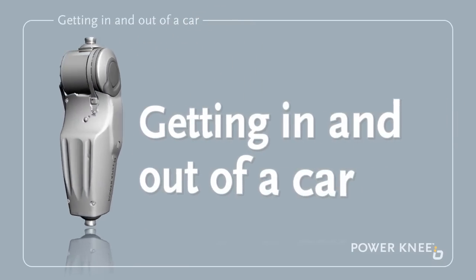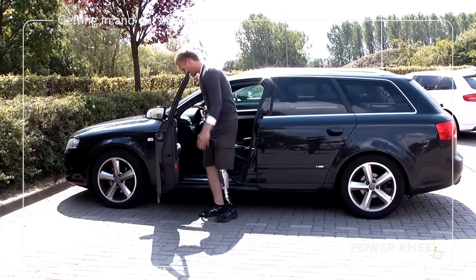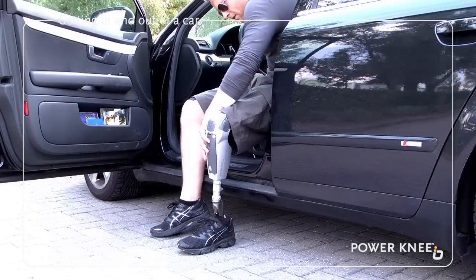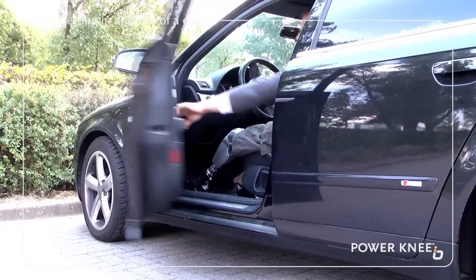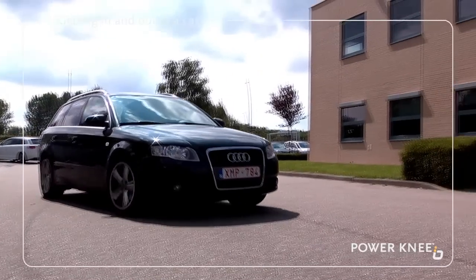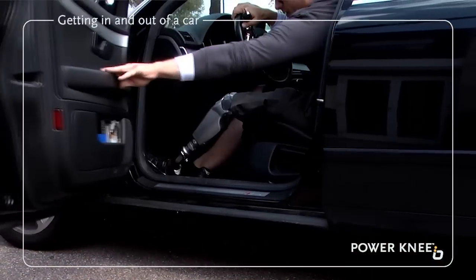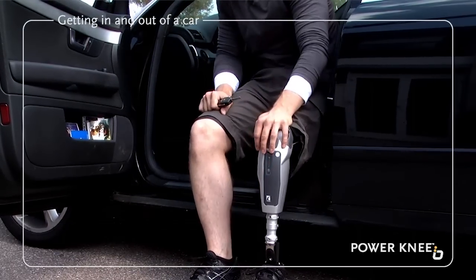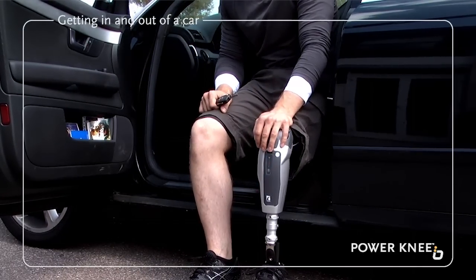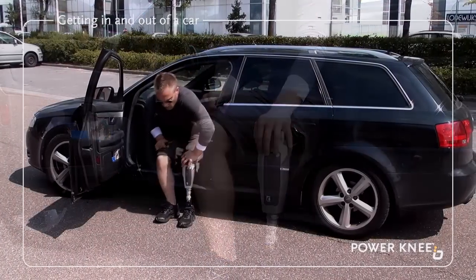Getting in and out of the car. Sit down on the car seat facing sideways. Turn the prosthesis off, then manually move the prosthesis into the car and face forward. We always recommend you keep the power turned off while driving a motor vehicle. When getting out of the car, manually move the prosthesis out of the car and position it on the ground. Turn the power on. Wait for three seconds for the prosthesis to detect its current position and stand up as normal.